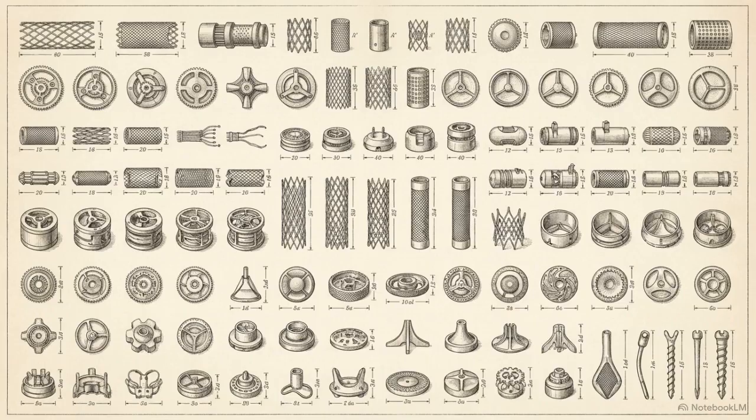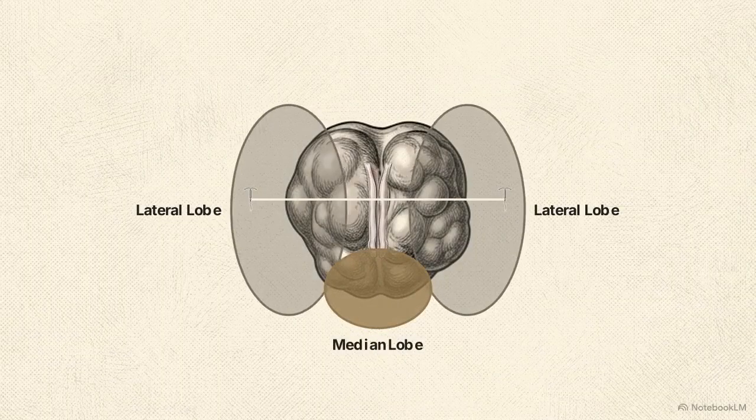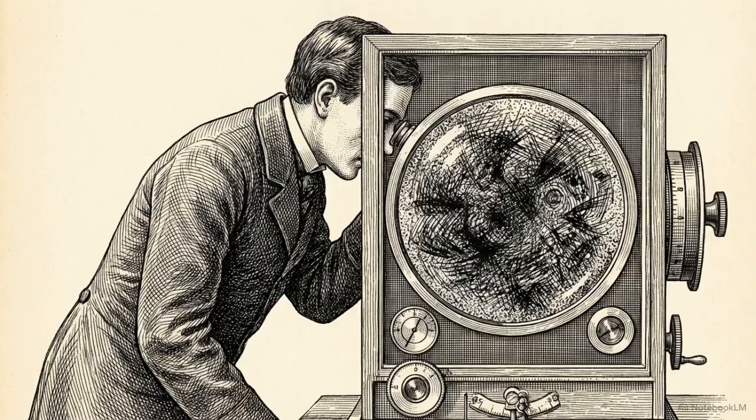Understanding this lobar origin also dictates hardware choices. Prostatic urethral lift implants pull hyperplastic lateral lobes away from the urethra, but their deployment geometry is unsuitable for an obstructing median lobe. For radiologists, pre-existing hardware creates significant diagnostic blind spots.